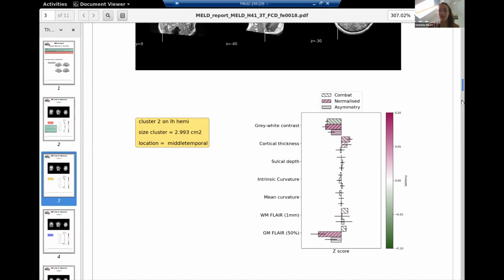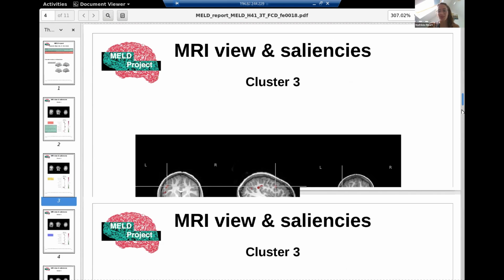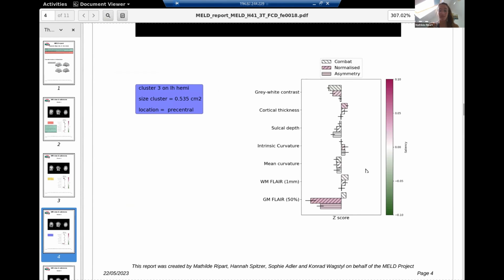So here we know that this is mainly artifacts due to FLAIR artifact that we have on our sequence at GOSH specifically, because when we rerun this without the FLAIR sequence, most of the false positives are removed.